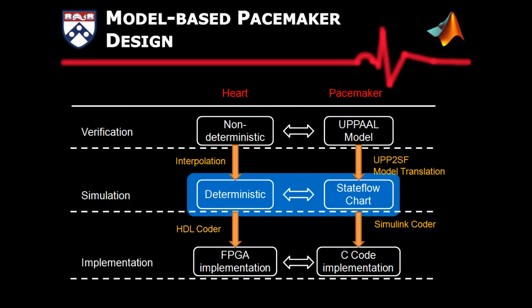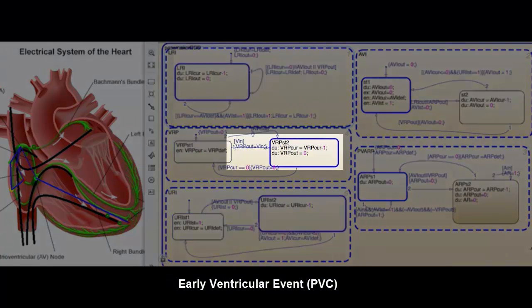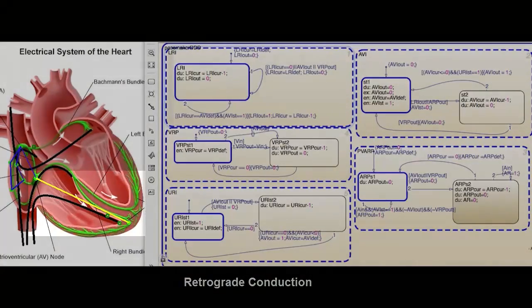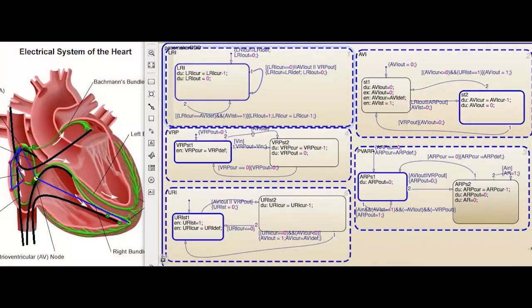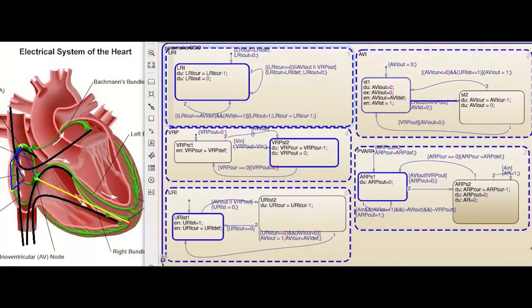Now we demonstrate the ELT behavior using our Simulink simulation. The left-hand side shows the MATLAB GUI and the right-hand side shows the Simulink pacemaker model. As we can see, a PVC triggers the retrograde conduction, which triggers an atrial sense in the pacemaker. After the programmed AV delay, a ventricular pace is triggered, triggering another atrial sense and the ELT is initialized.